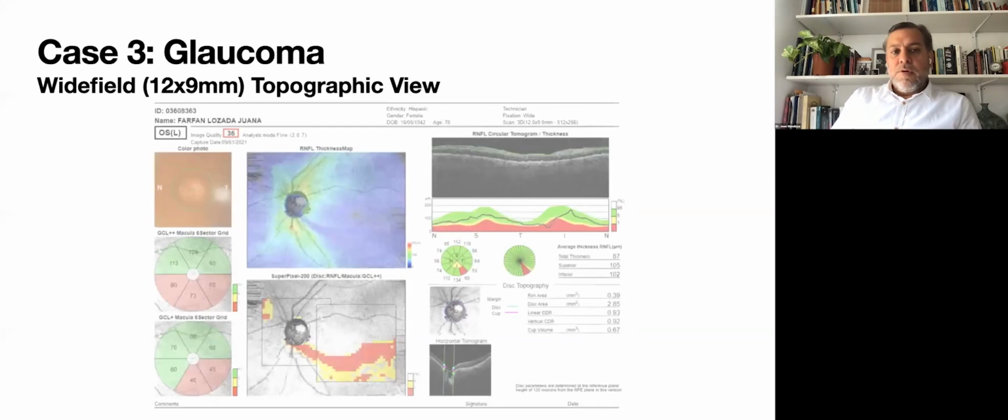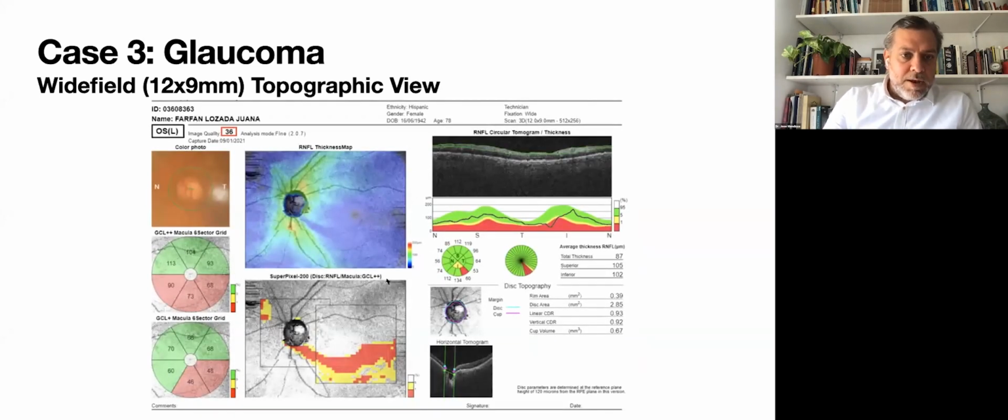Let's see another example of another glaucoma patient. Again, you will see the GCL starts with a lot of defects. If you see the quadrants here on the thickness map, these numbers, all the metrics, because they are so big, they could be within normal limits. Here is a defect that we are looking for, and it's shown here.